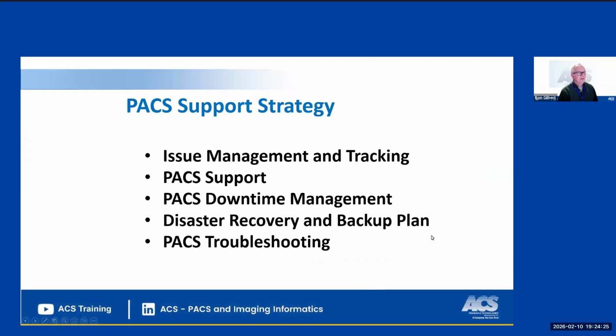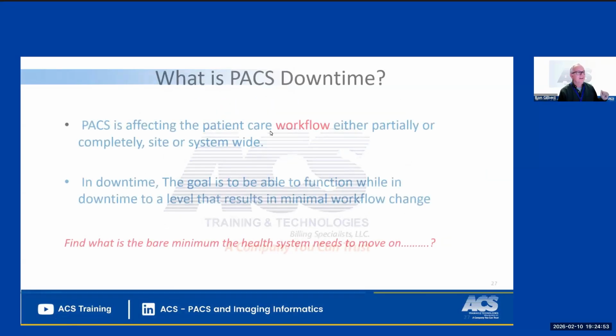Then the big thing, how do we support it all? So I now showed you what it is, a little bit about what makes it work. And understanding that is how you can actually go fix it, because when you know what it's supposed to do, you can look at what it's not doing, and then you go back and make it do it again. And that's really how troubleshooting works. So you have issue management, downtime management, and then disaster recovery, and then the troubleshooting part. That's when you're talking to the people who are having trouble. Troubleshooting, yeah, there you go.